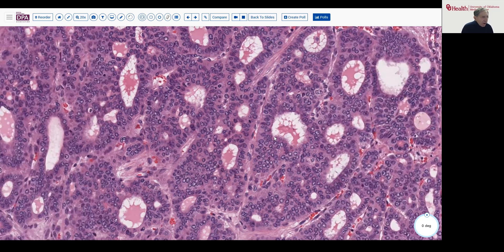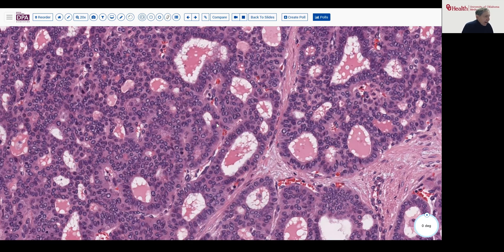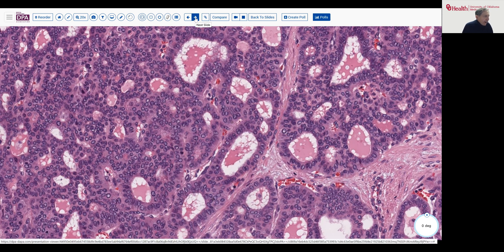So what markers could be used to verify origin from the liver? CK7 could be helpful, but it's not totally specific. One marker that has been used and is quite helpful for identifying hepatic origin, particularly in biliary tumors, is the presence of messenger RNA in situ hybridization for albumin messenger RNA.